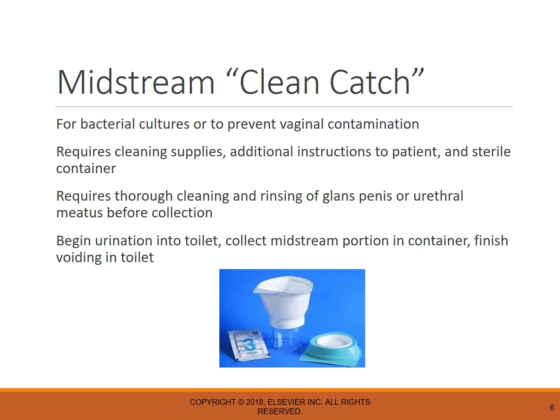To prevent contamination of this specimen or the container, the interior of the container must not come in contact with the patient's hands or perineal area. So in essence, this technique allows the passage of initial urine that contains any kind of urethral washing or normal flora into the toilet, and allows collection of a specimen that represents elements from the bladder, ureters, and kidneys.